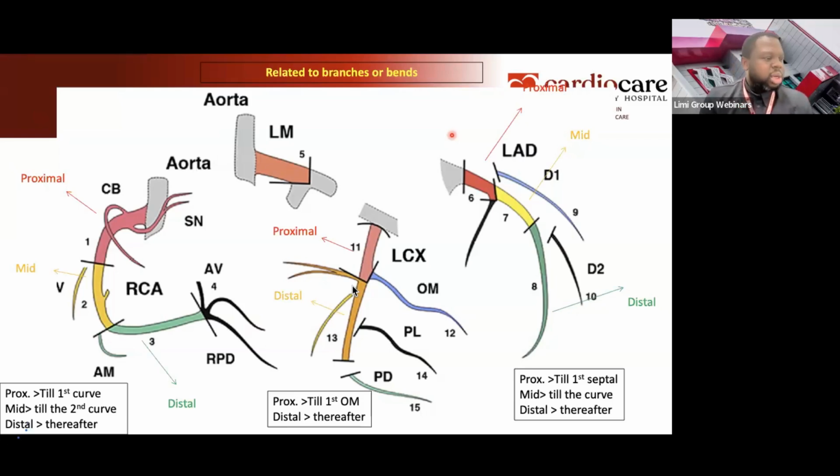In fact, the last case I did, the patient had a normal coronary CT, but he had a very tight 99% left anterior descending blockage and another blockage, two blockages actually. We decided to leave the second one and I stented the first one, but the coronary CT was reported as normal. So sometimes that could be a limitation of CT until you do this. Coronary CT is just to guide us, or to help us in atypical patients that have atypical cases. I'm not going to go into the indication for coronary CT as opposed to coronary angiogram.